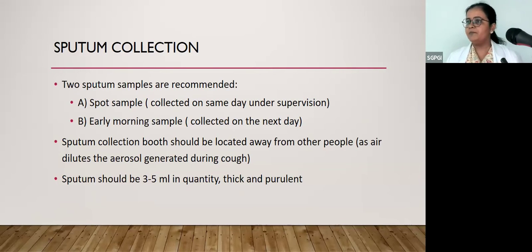अगर कोई कलेक्शन का बूथ नहीं है तो दीवार की तरफ फेस करके भी स्प्यूटम कलेक्ट कर सकते हैं. पेशेंट जो है और जो अटेंडेंट है he should wear mask and proper protection. Sputum should be at least 3 to 5 ml in quantity, thick and purulent.